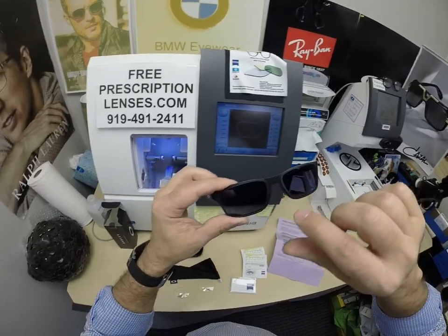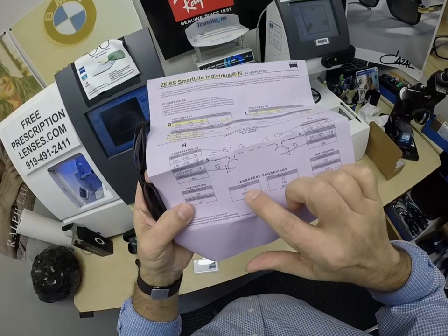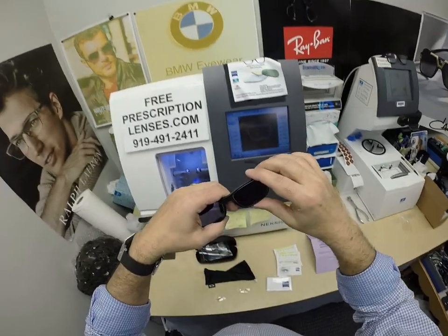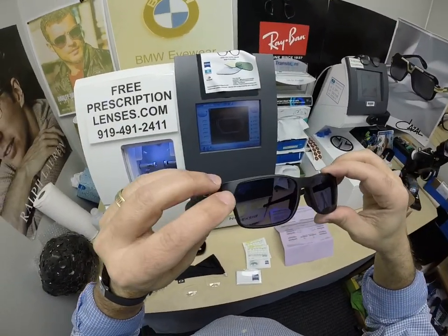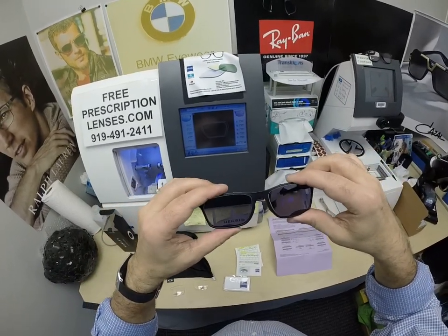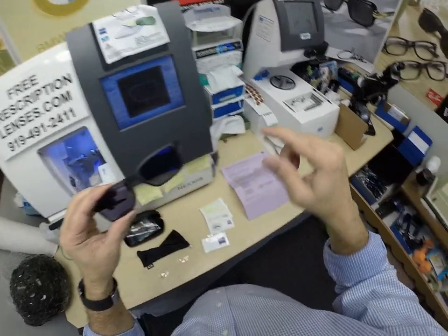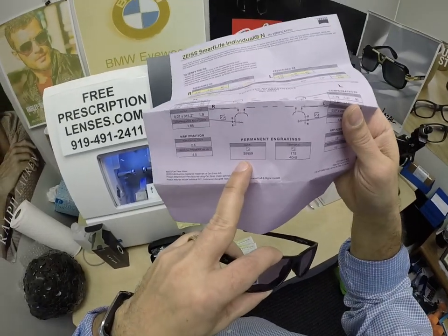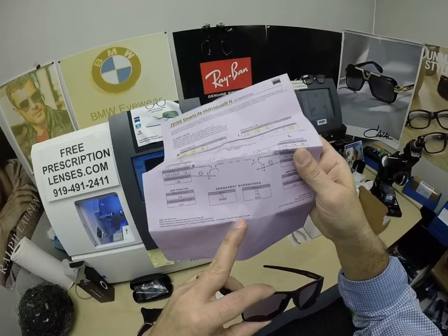You can actually see that Zeiss laser engraving in the corner of the lenses when they're dark — it looks like a Z inside of a square, and that is the Zeiss emblem. You can see that in the corners. That's how they do branding so you know you're getting the authentic product. You've also got the laser engravings in the nasal portion of both lenses and the temporal portion. The SI stands for Smart Life Individual, 1.59 is the refractive index of polycarbonate, and the 40NF is the logo for the lens design.